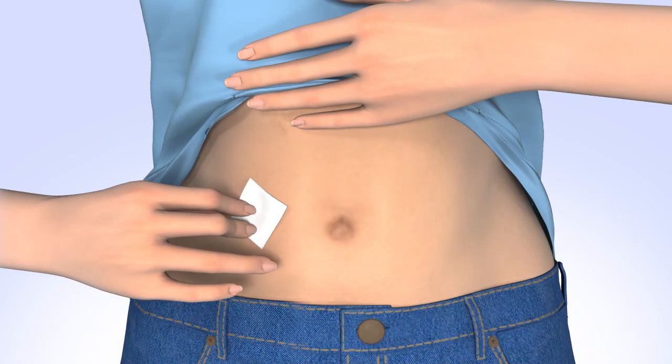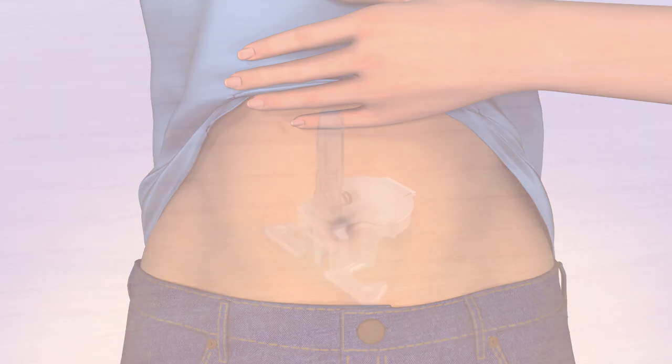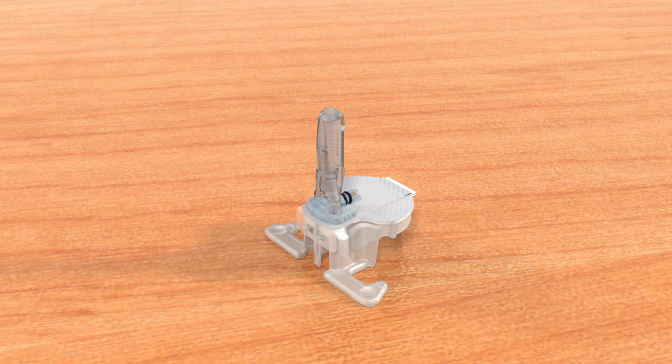Clean the insertion site with alcohol and let the skin dry before inserting the sensor. Do not use any other product or tape on the site before inserting the sensor. Let's take a closer look at the Guardian Sensor 3. The sensor is attached to the top of the plastic pedestal that keeps the sensor in place while loading the serter. The plastic pedestal has two arms on either side. On the top of the sensor is the needle housing which holds the needle in place. The needle is removed after insertion.